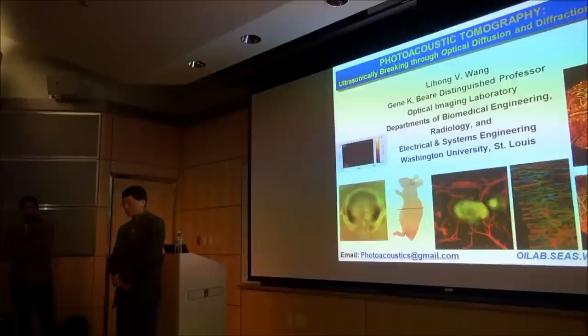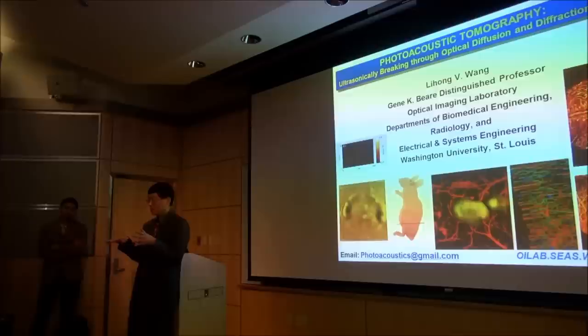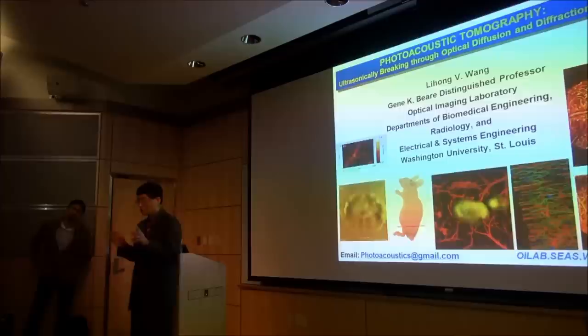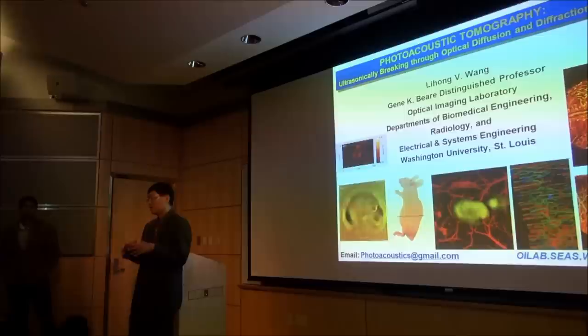In practice you've got to watch the inversion stability. Ultimately it's all SNR limited. So the matrix inversion has this so-called condition number. Mathematicians have worked all that out. So if a matrix has a low condition number, then you don't have to have a very high SNR to invert it. Otherwise, you have to push the SNR to make sure that inversion is not going to generate garbage. So with two wavelengths, you can do that very reliably by choosing the right wavelength pair. With three, you can still do that very reliably in a very rapid fashion. But as you push to 6 or more, you just need to design very carefully.